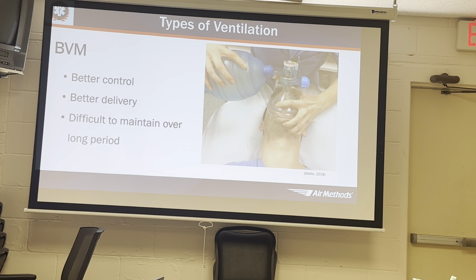Some of them, if they're not in the bag, are actually tied to the bag. Yes, putting that PEEP valve on there. Sometimes they come with the spring all the way out, so it's not giving any PEEP, so turning it to 5, and making sure that we're maintaining that mask seal, because that PEEP valve does nothing if it's either off, or we're not maintaining a good mask seal, or if it's turned to 0. So no point in even having it on there if that's the case.